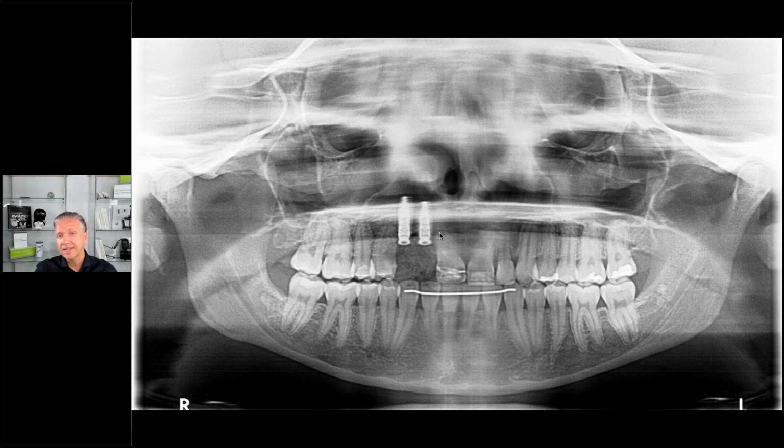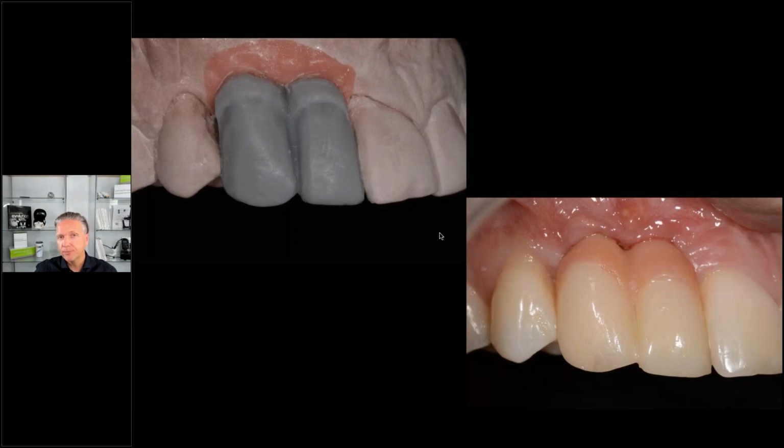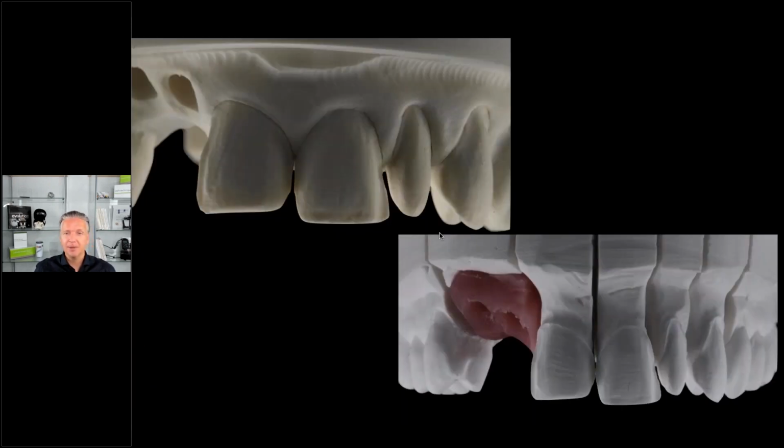So he got her to see here with a little provisional Maryland bridge in her mouth and said, I cannot send you home like this, right? So we have to do something. He made a quick wax-up, made a quick immediate provisional in her mouth all the same day so that she can go home properly. In the meantime, they also scanned her. He also took physical impressions here. When we work together, we always try out that digital-analog process. How accurate is it? So we always have confirmation. We do that quite a bit.